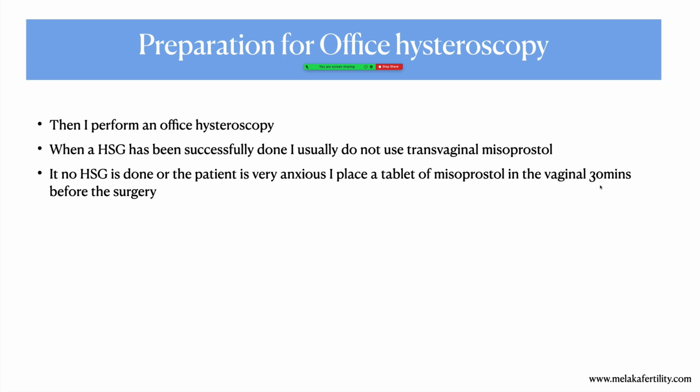I usually put it only 30 minutes before the surgery, and many people put it many hours before. I find 30 minutes is sufficient. The reason is because I don't want the cervix to be too dilated, and that will cause leakage, and that causes the whole problem. So just about 30 to 45 minutes, at maximum 1 hour before the procedure, is sufficient in most patients.